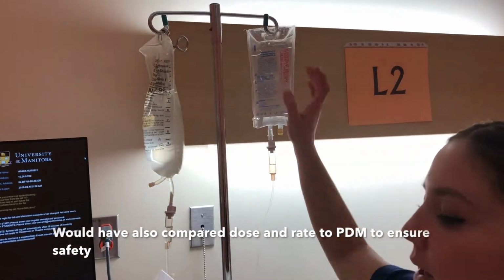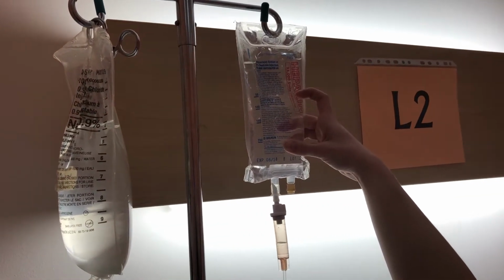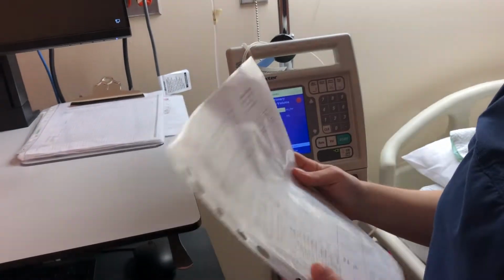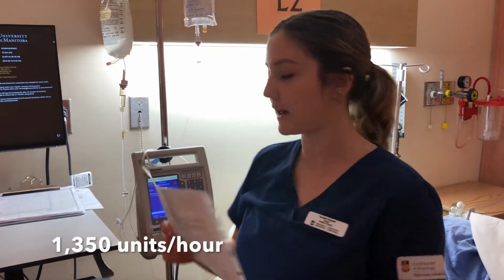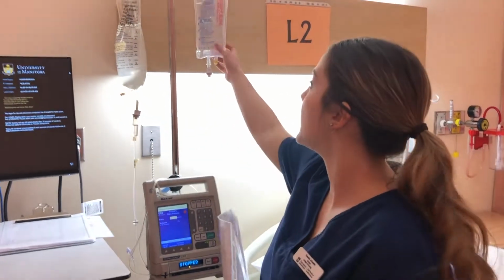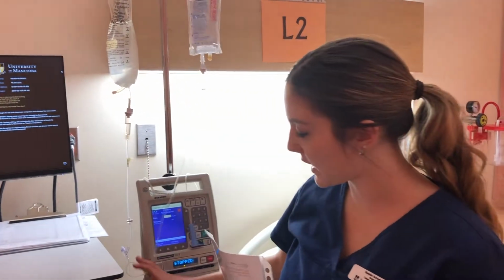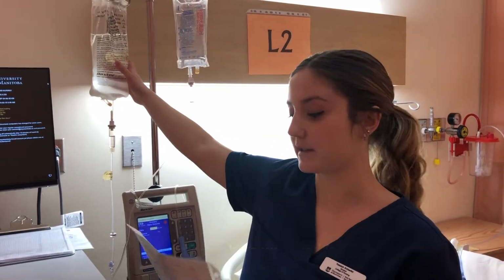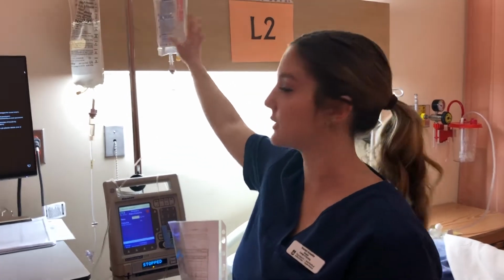So heparin is my drug. Heparin here, 25,000 units for a final concentration of 100 units per ml, which is what I have here. And for my order, I'm going to be starting it at 1350 units an hour, so I'll have to program that into the pump. This bag is not expired, and I've noted that the tubing is primed already, and it's also hanging with normal saline, which I checked in the monograph is compatible. And I also checked in the monograph earlier that the rate is within safe limits.